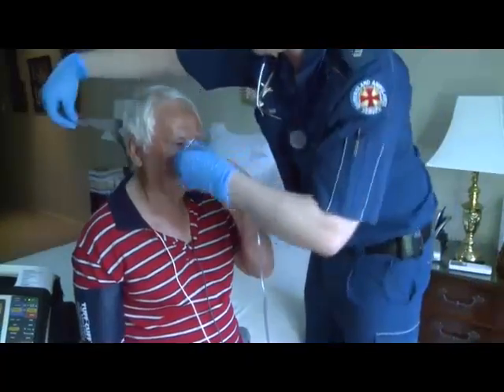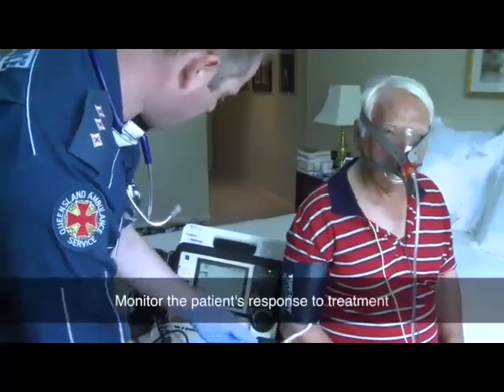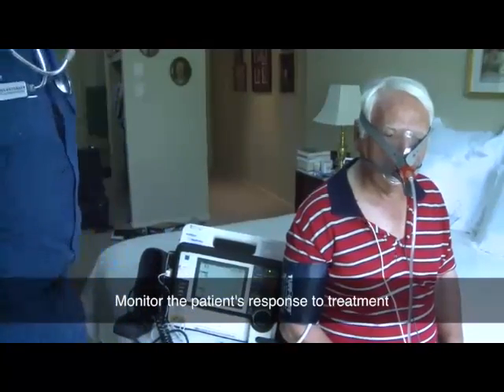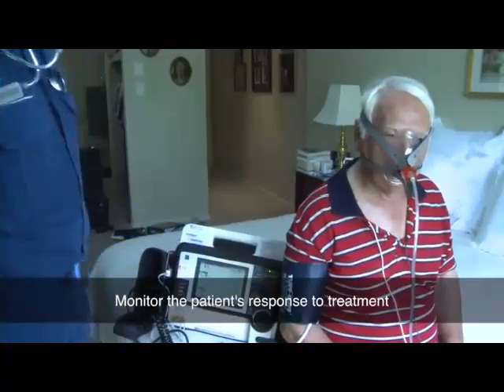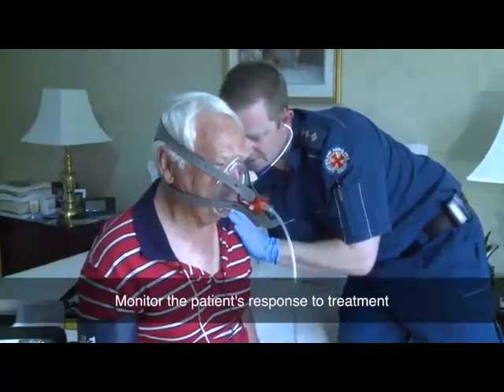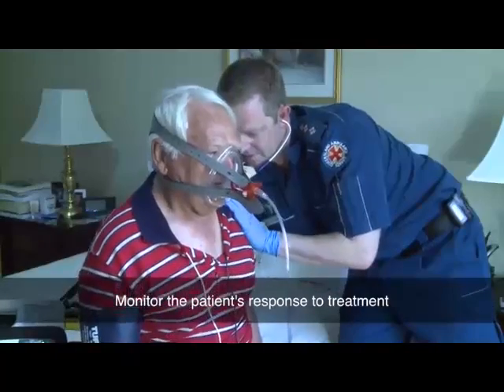Monitor the patient's response to treatment, specifically their respiration rate, SpO2, blood pressure, chest sounds and work of breathing.